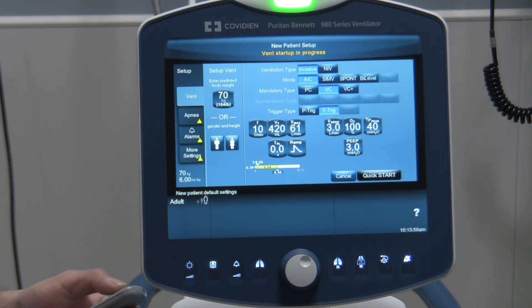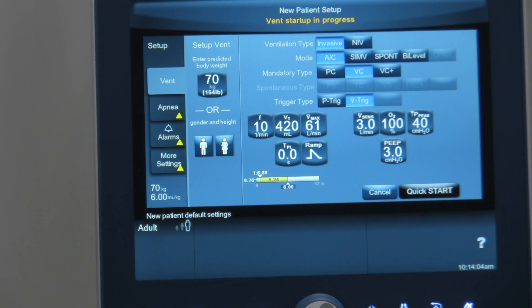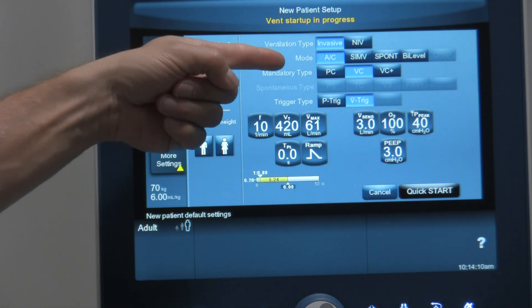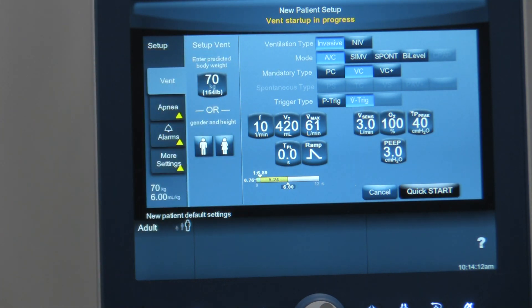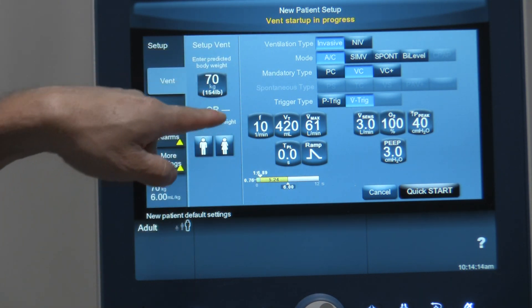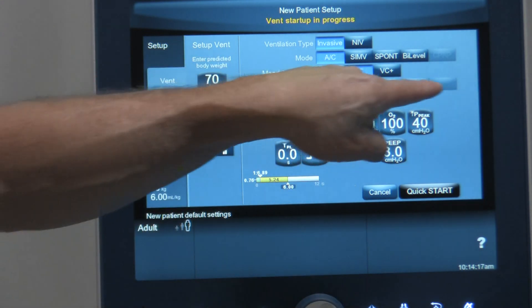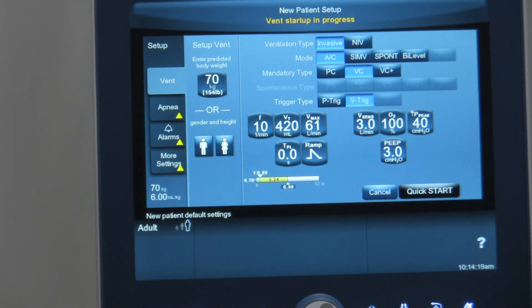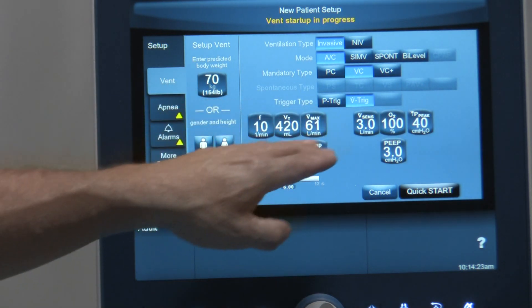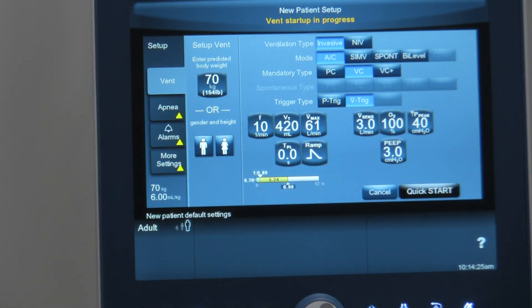Now if you look at the top right-hand corner of your screen on the ventilator, what you'll see is that it gives you the information for choosing ventilation type, mode, type of breath you want the patient to get. If you chose a mode that allowed for spontaneous breaths, you'd have a choice of spontaneous breaths there. Then there's the type of trigger that you want, and all the settings applicable for the mode that you're in.